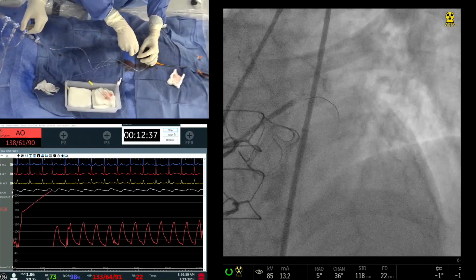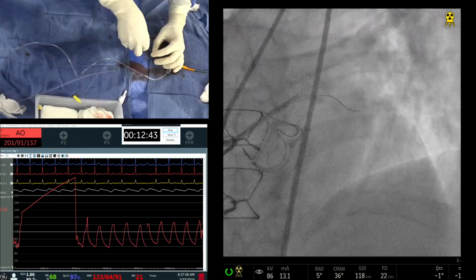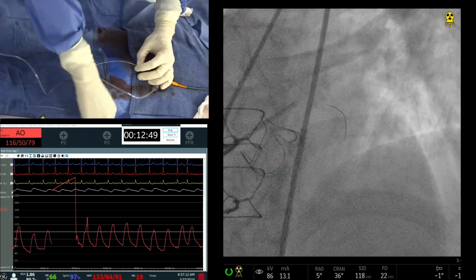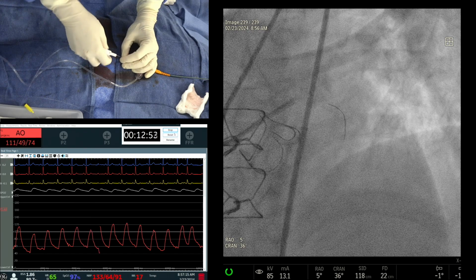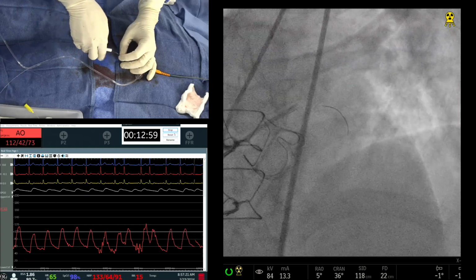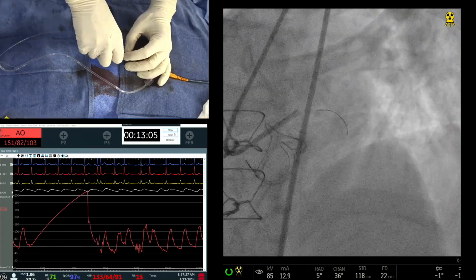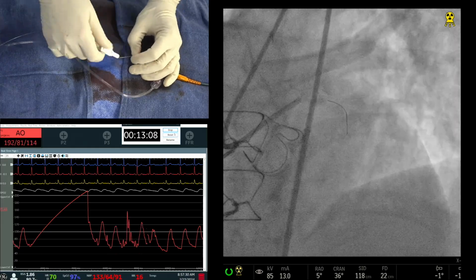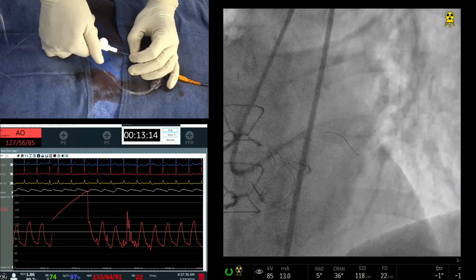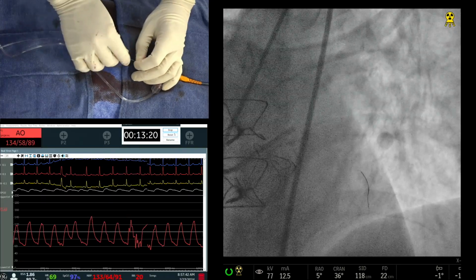That's the diagonal. It's the curve, the tip. Yeah, the tip probably with the circ has become straightened. I think that's what is happening. You want to ask for a deep breath? Is the Fine Cross ready? Yes. We can go to the tip of the Fine Cross and change it, I guess. Ask for a deep breath at this level. Okay, take a deep breath. Still, I think, the diag.